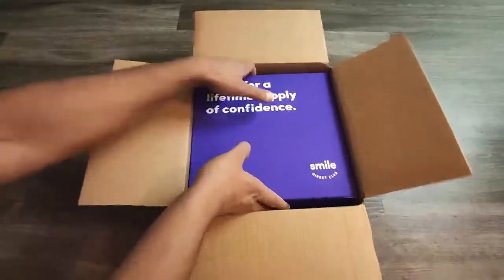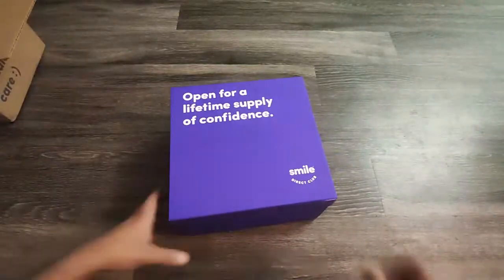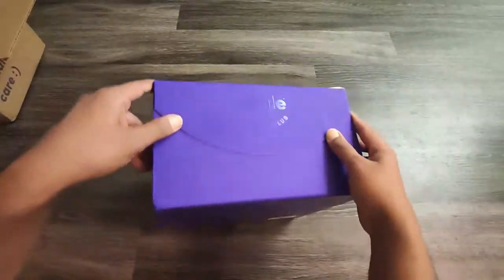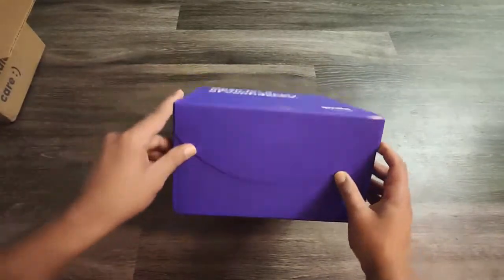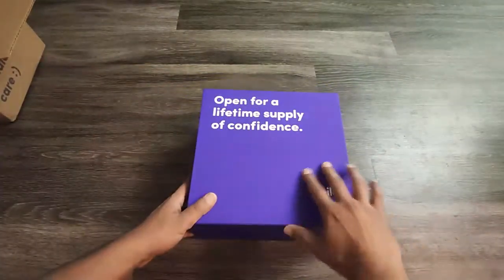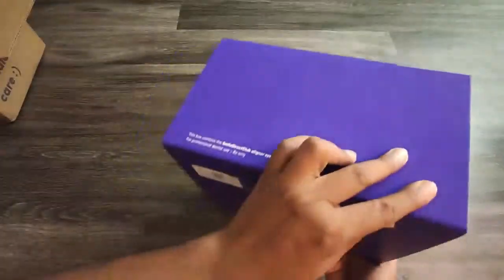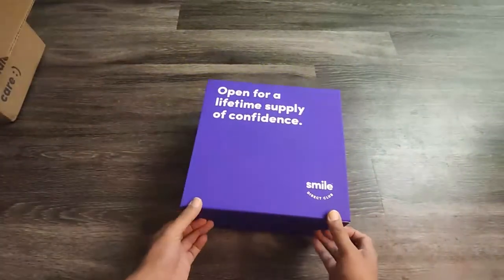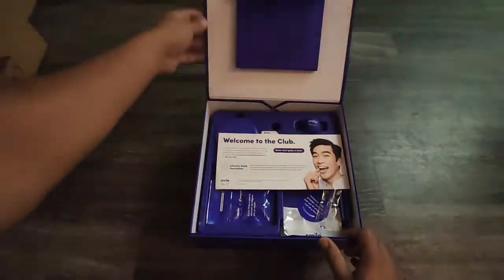Inside the package you can see there is a box which holds all the contents of my aligners. I'll open this box — you can see it has a rubber finish and 'SmileDirectClub' is imprinted on it. The box looks good overall, with a design on the sides and a rubbery finish throughout.